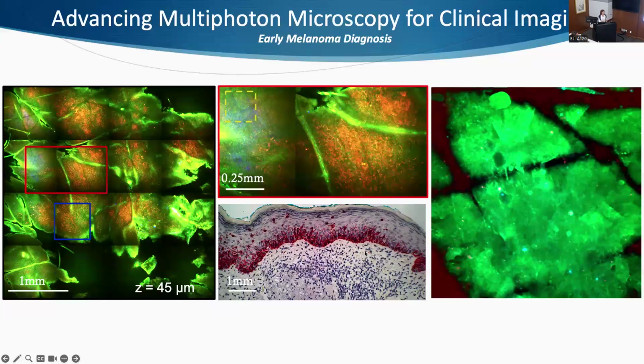What's happening in melanoma is that when they start proliferating in this basal layer, they also start shooting up. It's called pagetoid spread. And when we image with our microscope, this is what we are looking for, these melanocytes in upper epidermal layers. When I start this video, I want you to pay attention to start seeing them.